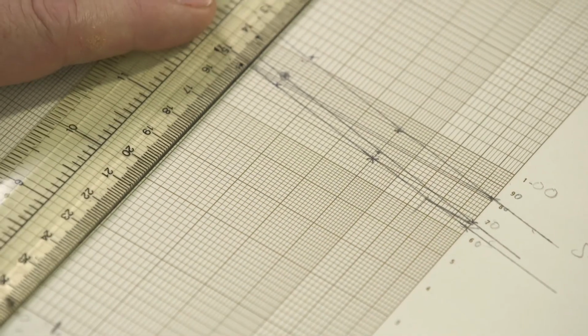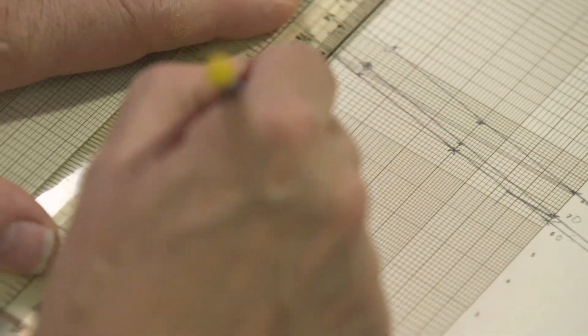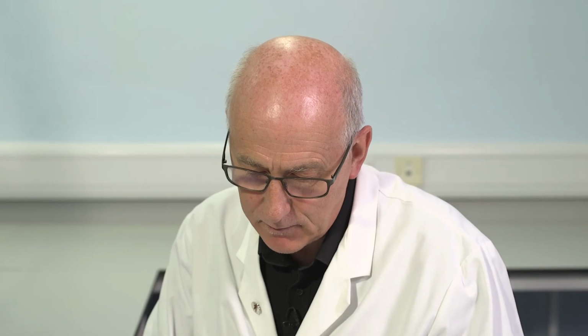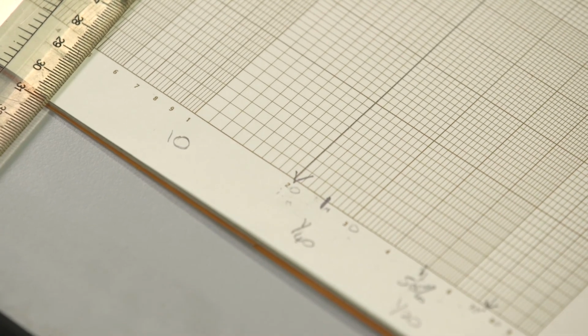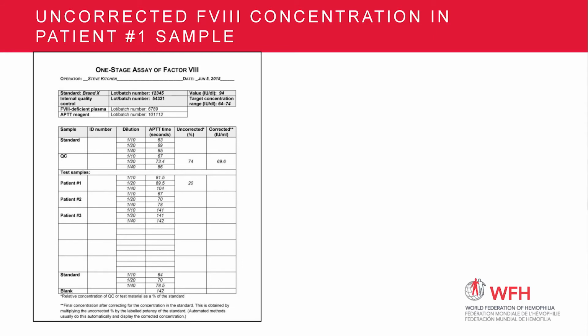Here. We drop a perpendicular from 82. 20%. The concentration of this sample, test sample number 1, is 20% of the reference or calibration plasma. So not yet corrected, 20%.